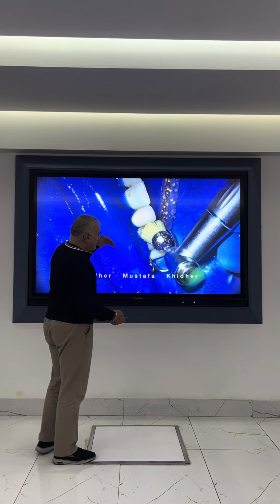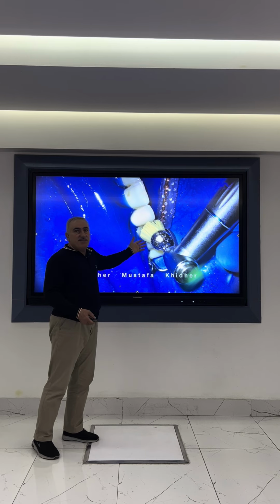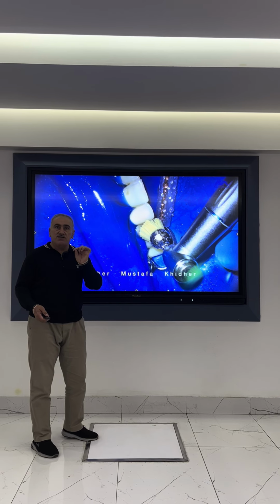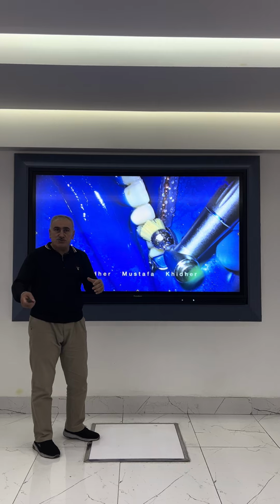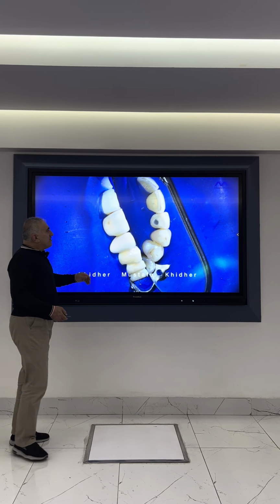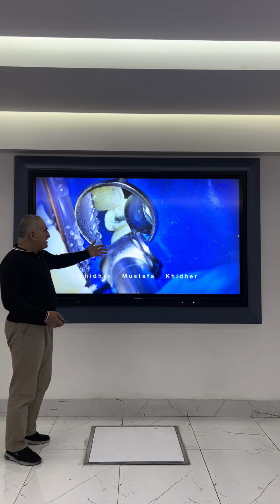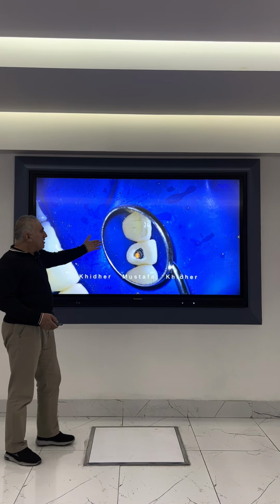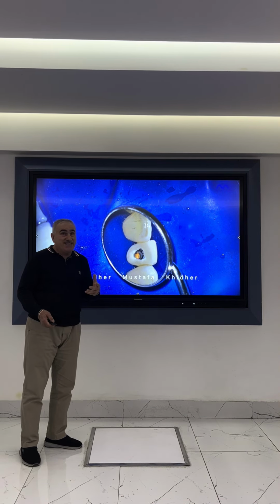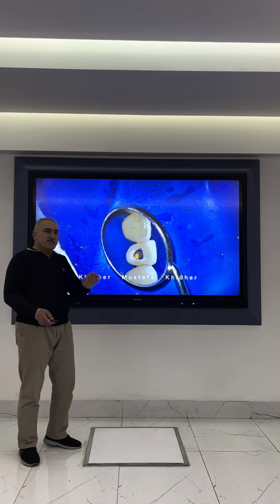The golden step that I should follow is to clean the operative field, because we know we are fighting bacteria. So every treatment modality should be directed in a way that we control and minimize the number of bacteria. After I clean the area, I put the rubber dam to have an aseptic environment. I remove the composite before. So I see the guttapercha, but the access opening is really not a standard access opening for me for this case. It needs more correction or refining, small touching.